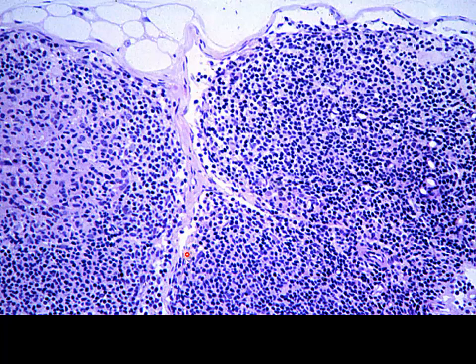Some call this a trabecular sinus. I've always heard it as a paratrabecular sinus because it goes all the way around. And this is going to divide that cortex into different compartments.